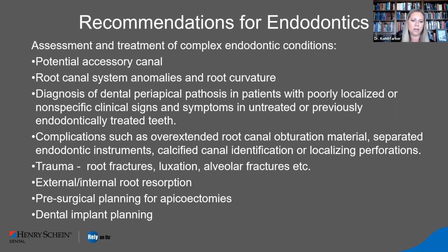Definitely, this would be a time to go ahead and take a CBCT. External versus internal root resorption, pre-surgical planning for apicoectomies or dental implant planning. So basically what it tells you is there's some pretty wide berth in here. If you feel that you need it, again, it comes back to the judgment of you sitting in your office. If you feel like you need it, don't hesitate.